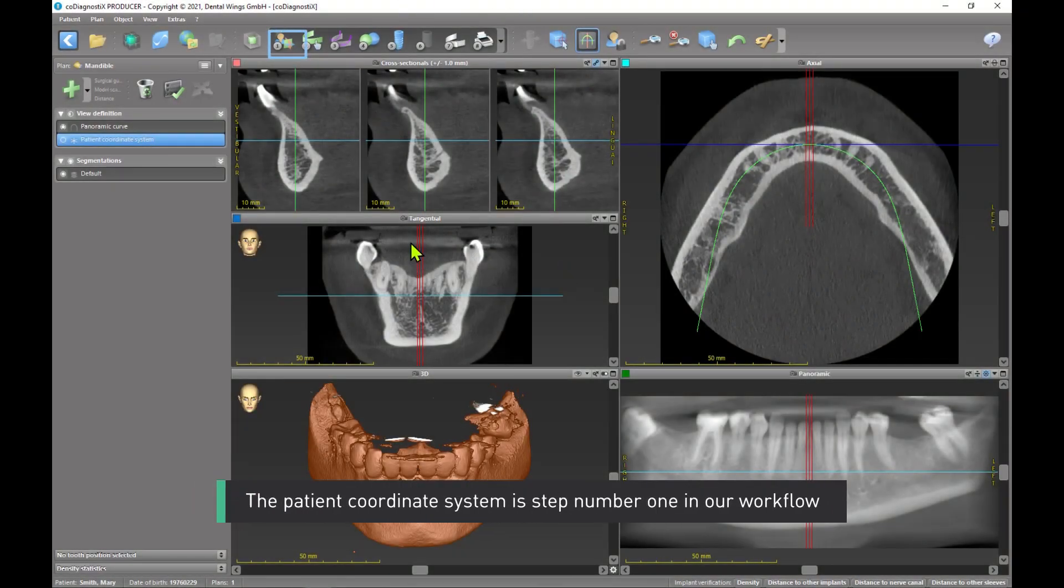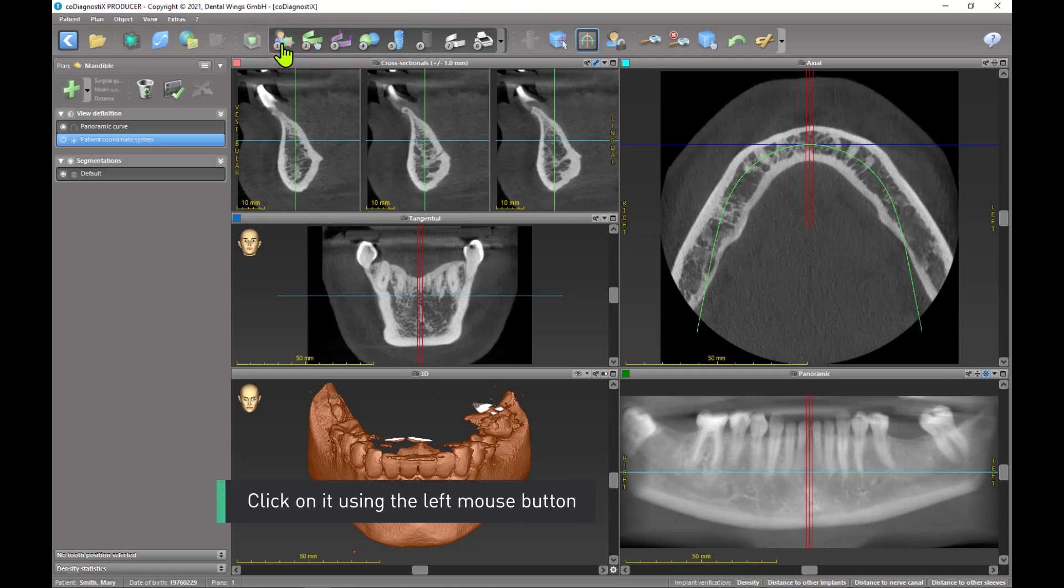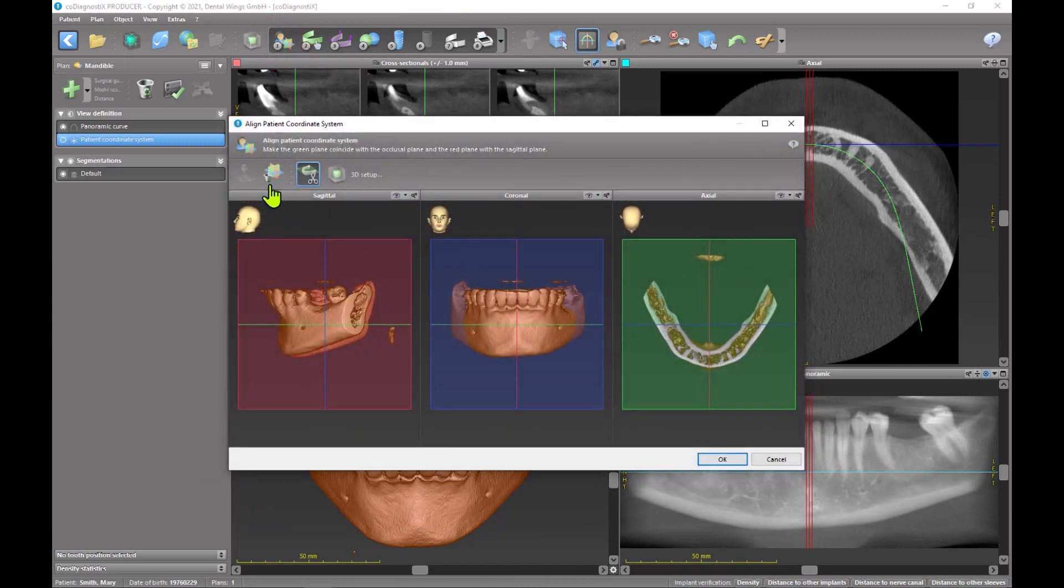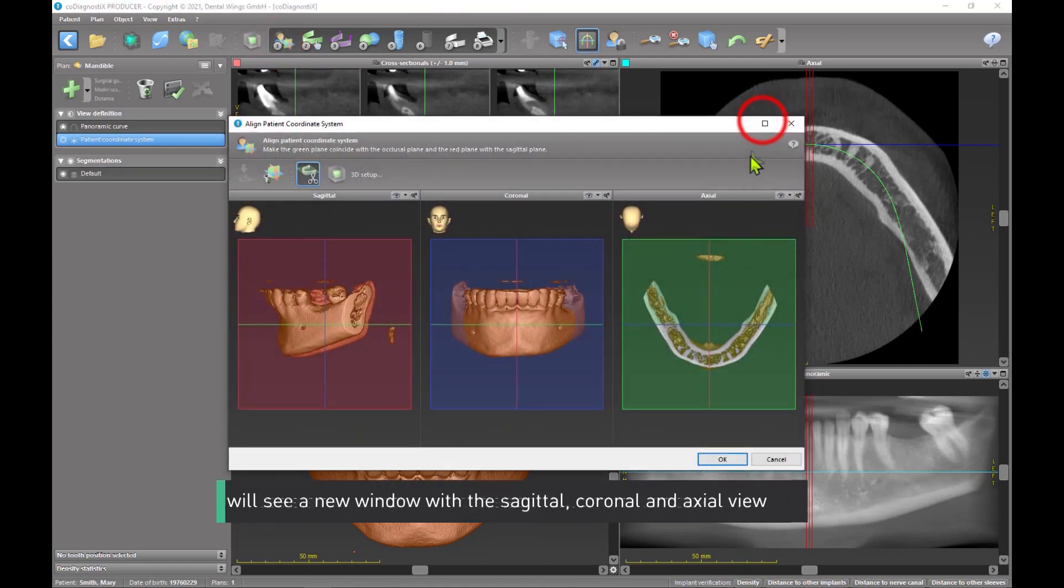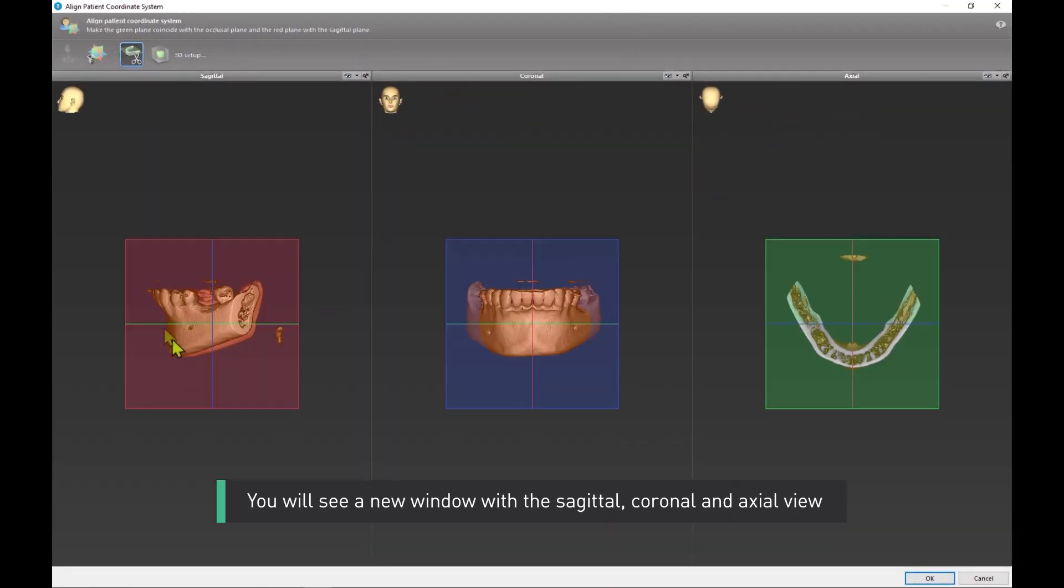The patient coordinate system is step number one in our workflow. Click on it using the left mouse button. You will see a new window with the sagittal, coronal and axial view.